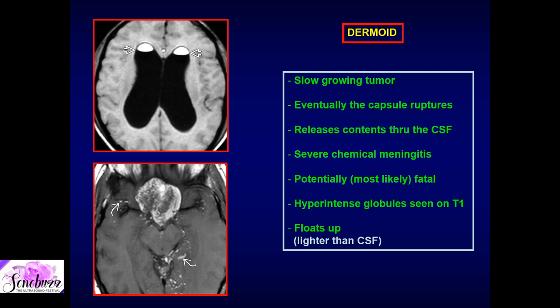On CT, ruptured dermoid shows low to fat attenuation with calcification and associated tooth and hair cells. On MRI, the signal intensity is very variable but there are components of susceptibility or calcification and T1 hyperintensity. When it ruptures, this same T1 hyperintensity from cholesterol floats superiorly along the non-dependent portion.